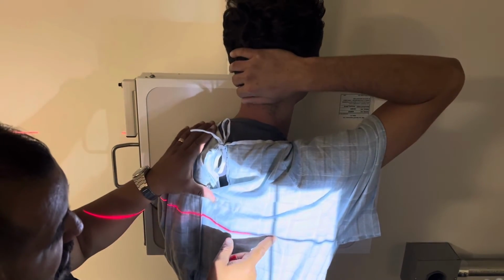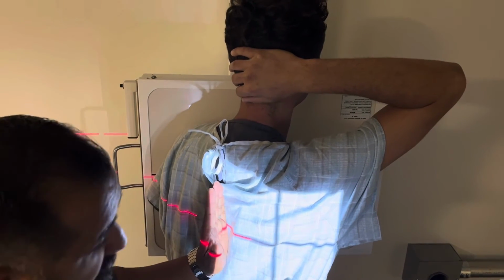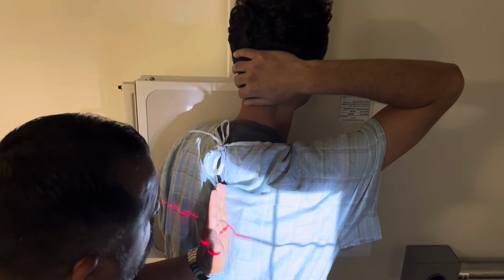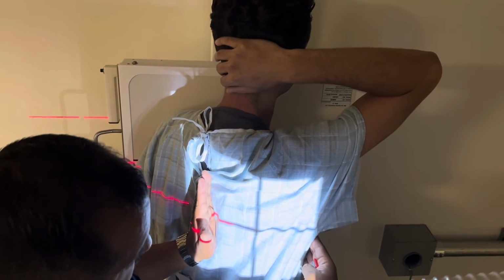Here is the inferior angle of the scapula. I like to put the central ray here. But if you look at what the textbook says, it says to place the central ray midline between the vertebral column and the elevated axillary border, which is here.